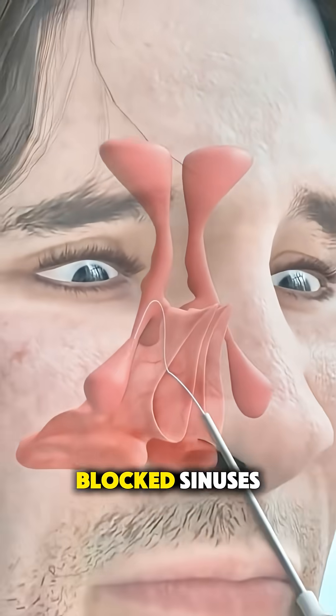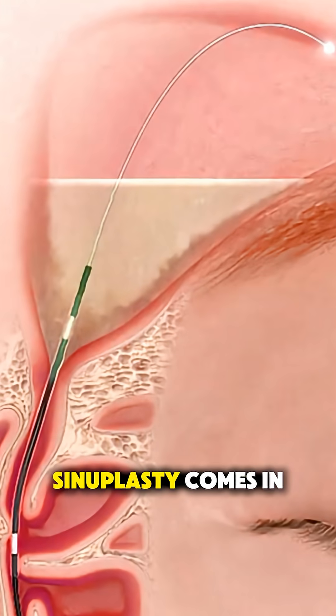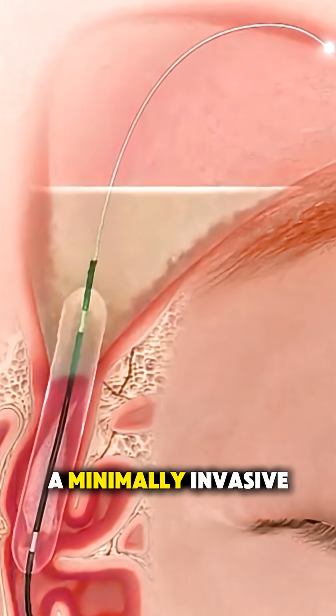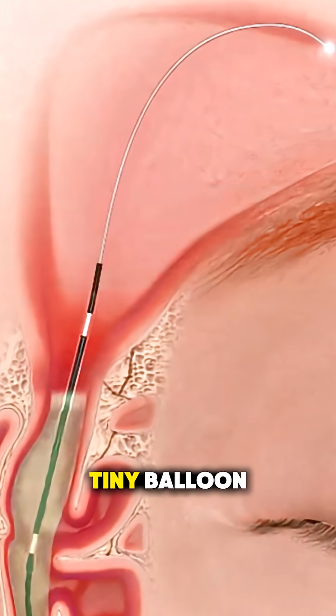Ever wonder how doctors open up blocked sinuses without traditional surgery? That's where balloon sinuplasty comes in — a minimally invasive procedure that clears sinus passages using just a tiny balloon.